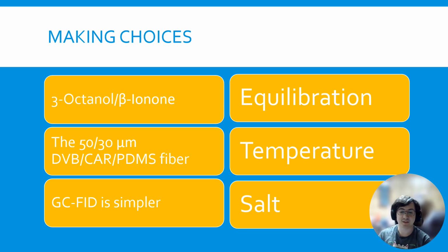Next step is temperature. This is the absolute biggest variable that we need to control. We need to lock this thing down tight in order to get good results. So that's why this one got its own, even though it's a big part of the equilibration step. Temperature at all phases needs to be controlled because temperature greatly impacts the end result.